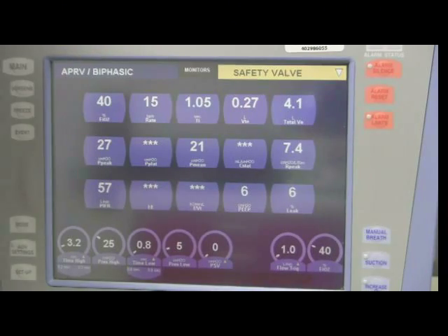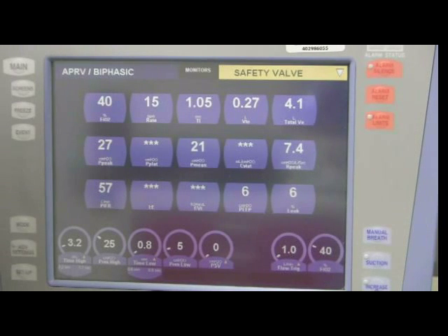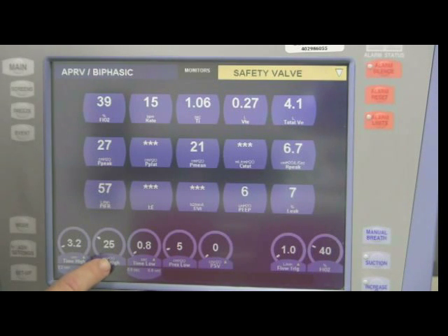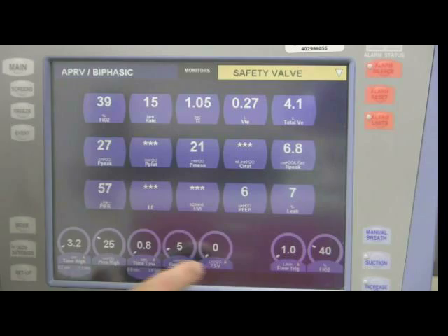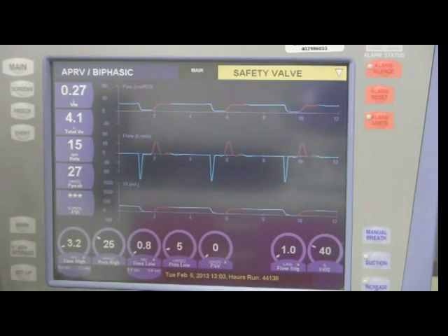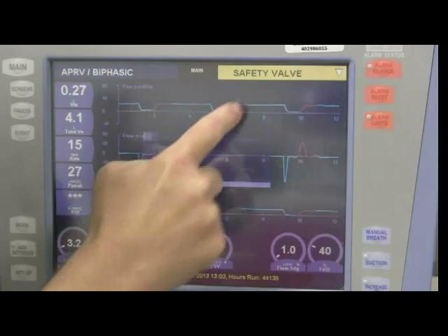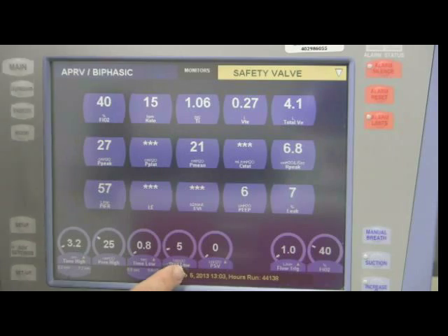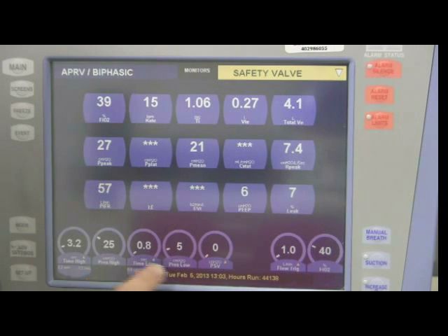Now let's take a look at the ventilator screen in APRV and I want to point out some settings. First is the pressure high — this would be equivalent to your peak inspiratory pressure, as we can see if we look at the waveform. The next setting is the pressure low, which would be equivalent to your PEEP. So we have pressure high and pressure low.